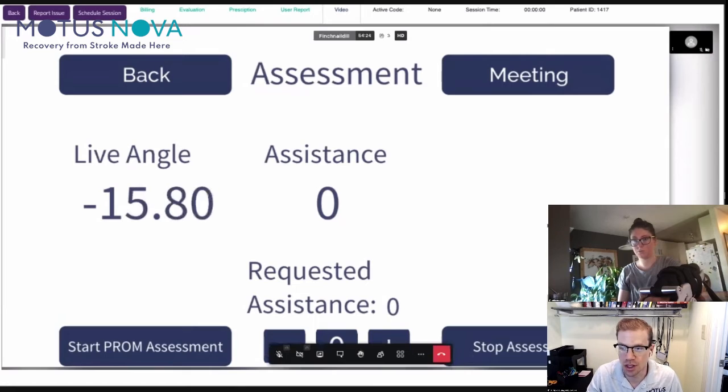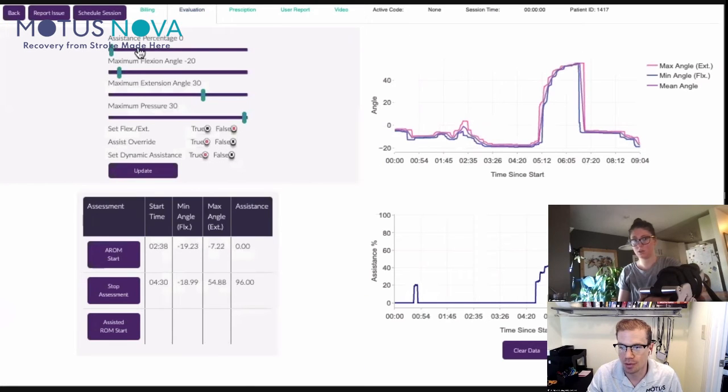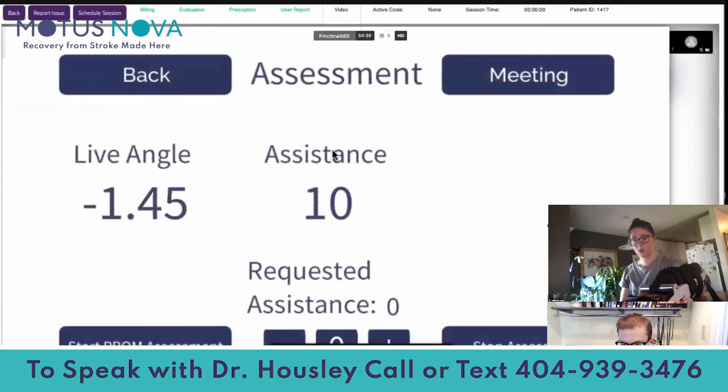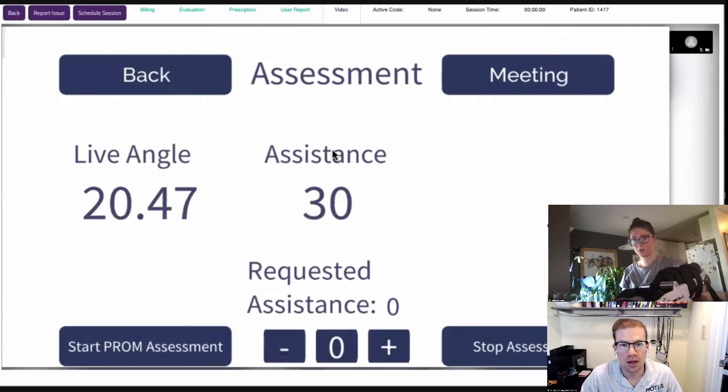So one thing we can do here is provide a little bit of assistance. Let's see what happens if those things change, if we have some forces there to help provide some feedback. Okay, so let's try this. Now, let's try to move up into extension as far as you can. Just do it gently, but try to move up as far as you can.